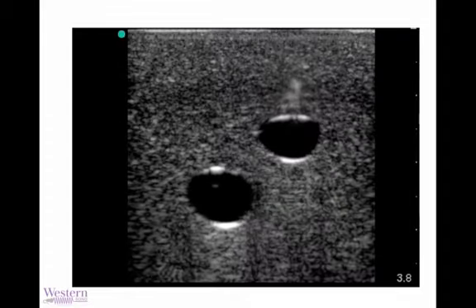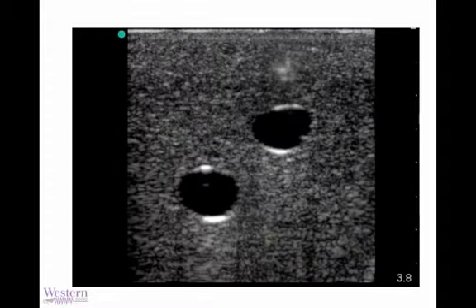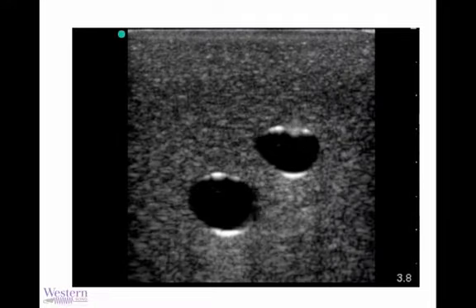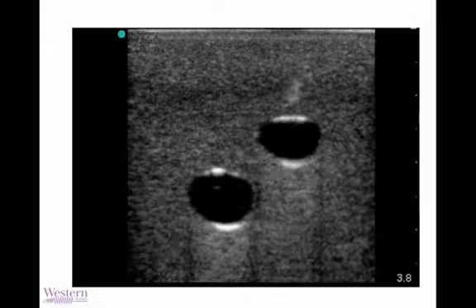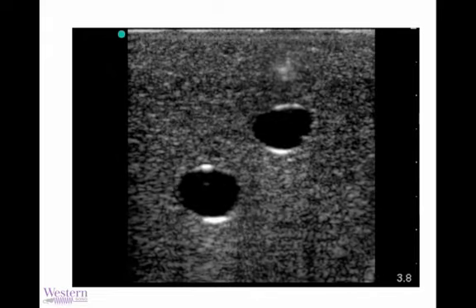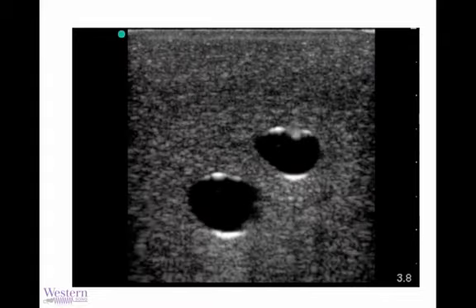So this kind of song and dance maneuver where the operator is clear at all points exactly what the leading edge of their needle is doing, and so is clear they will never, ever go anywhere they don't want to go, which is an incredible gift to your patients and a fun way to do the skill, because you'll find you can get a needle almost into any space if you use this technique called the creep technique, or call it what you will.